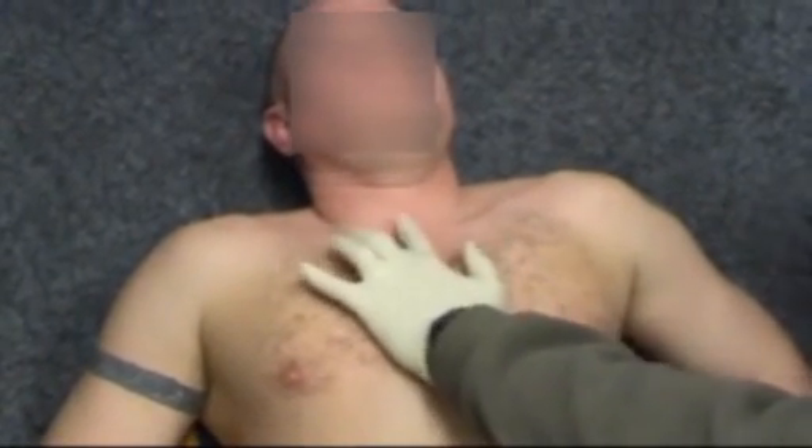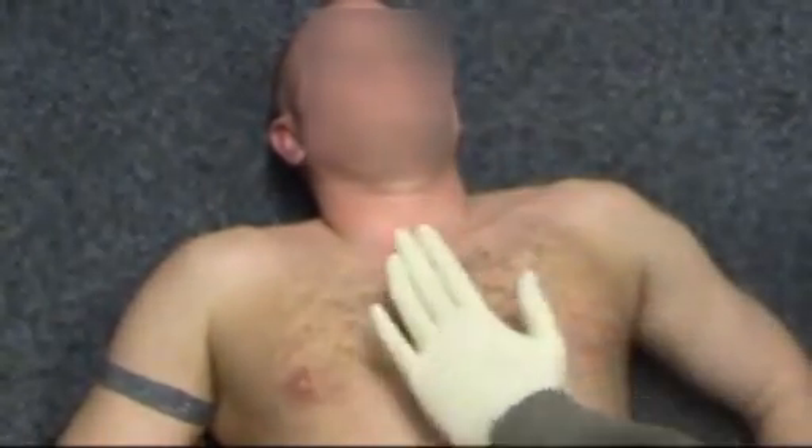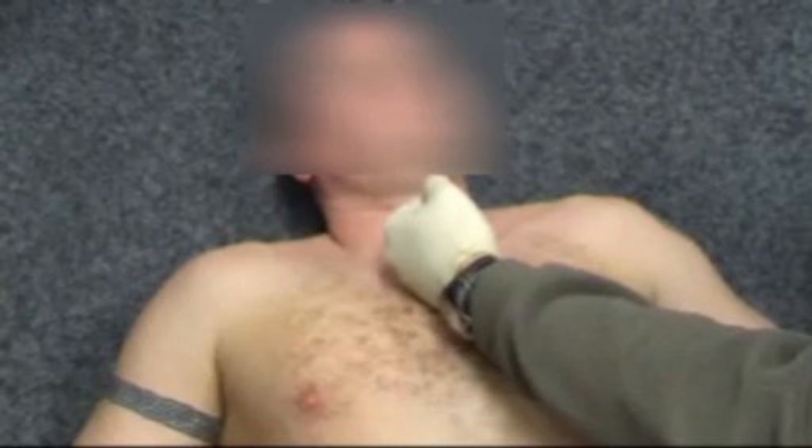So notice how his sternum curves — that's where the notch is. What you want to be is parallel to that. So it's not this; it's got to be parallel, perpendicular on the side, to the sternum.